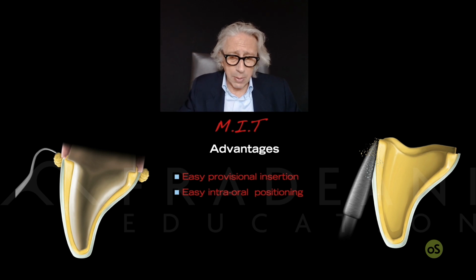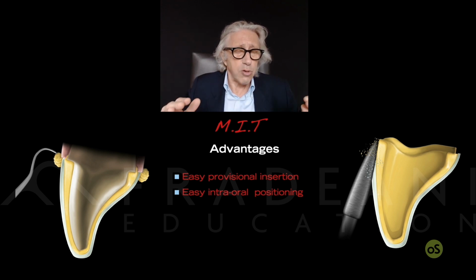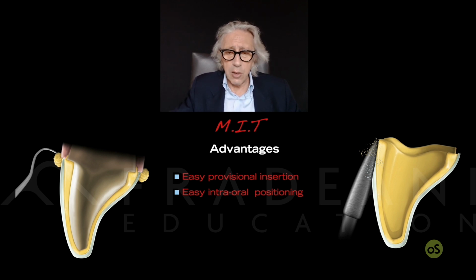In our case, in this patient, we had the mock-up still in place, great, but it can be the provisional, it can be what you want. The way and the moment you want to copy something working can be either the mock-up or the provisional. If the mock-up was not perfect and then you modify something, and the provisional now is perfect, you copy the provisional, not the mock-up. So in any way, if you have something to be copied, reproduced, at this point it can be the mock-up or the provisional.